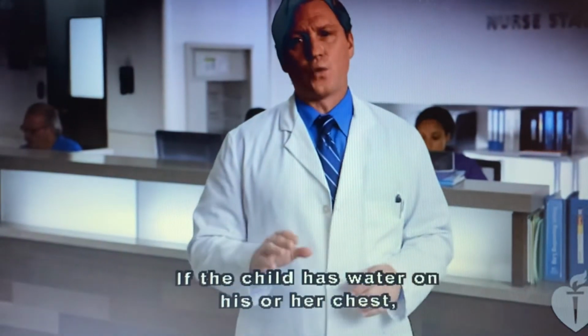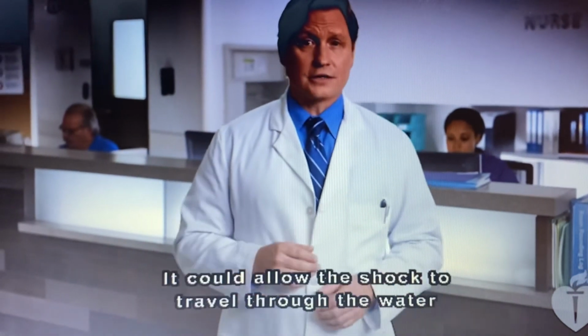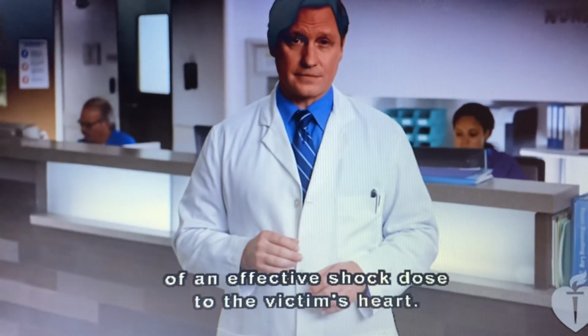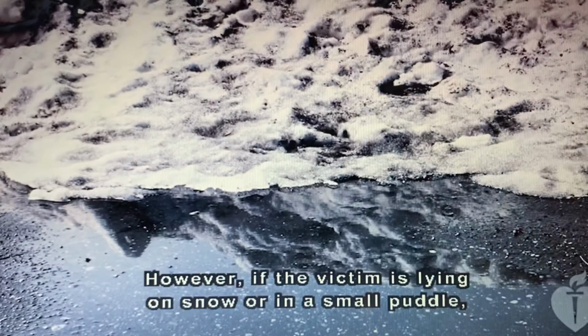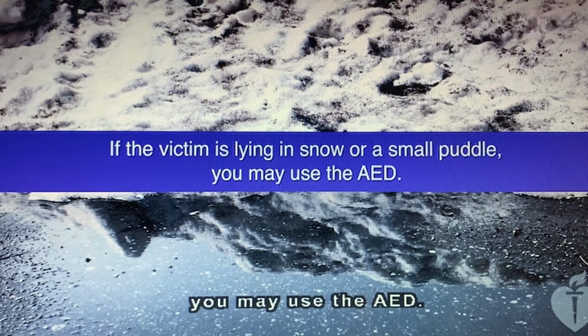If the child has water on his or her chest, this can be a problem. It could allow the shock to travel through the water between the pads, ultimately preventing delivery of an effective shock dose to the victim's heart. If someone is lying in water, you should quickly move the victim to a dry area. However, if the victim is lying on snow or in a small puddle, you may use the AED.